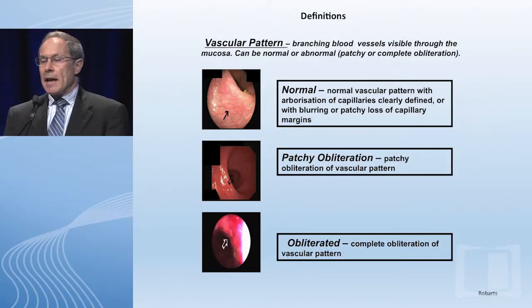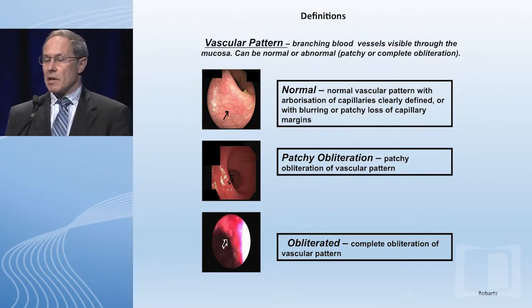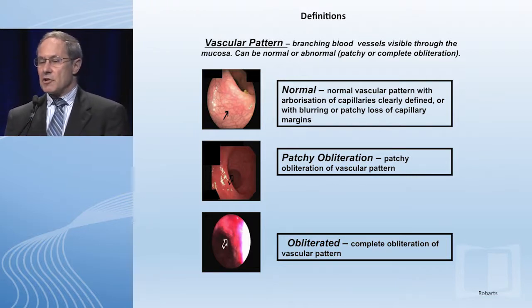And the descriptors, as you see on the left, and one's supposed to score the most severe lesions, you judge things on the basis of vascular pattern, bleeding, and then erosions and ulcers. And these slides will describe things fairly well, and I want to thank Brian Fagan and Robarts for sharing some of these definitions and some of these examples with us today.